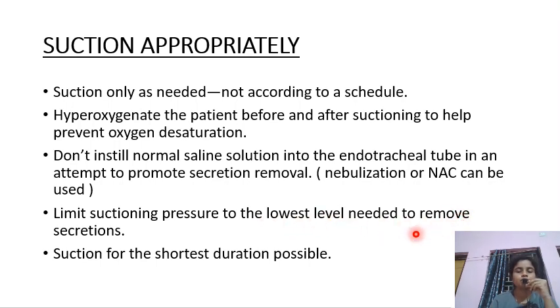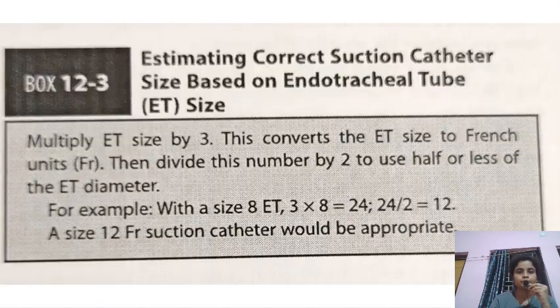If the secretions are very thick, you might need more pressure for their removal. Otherwise, if minimal secretions are there, always try to suction at a lower pressure, and suction for the shortest duration possible. It should not be more than 10 seconds.